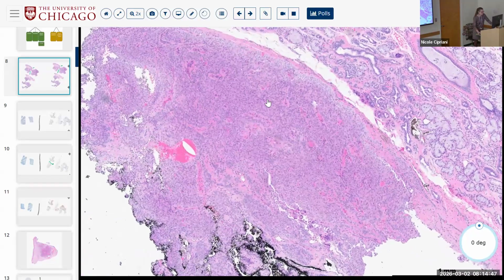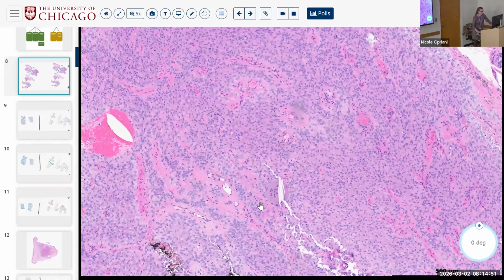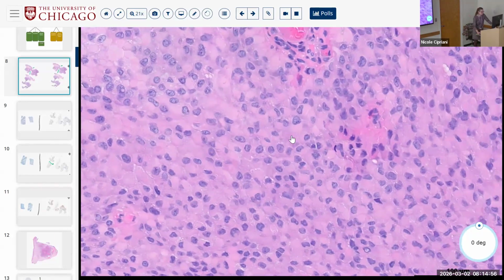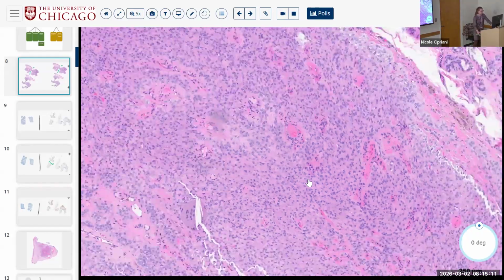But you know, you already talked about, is this something purely myoepithelial, or is this a myoepithelial rich variant of something else? These rhabdoid cells are sometimes referred to as hyaline or plasmacytoid myoepithelial cells. Hyaline, right, because the cytoplasm is very glassy and smooth and pink. And so this is very, very common in the tumor that this ends up being.